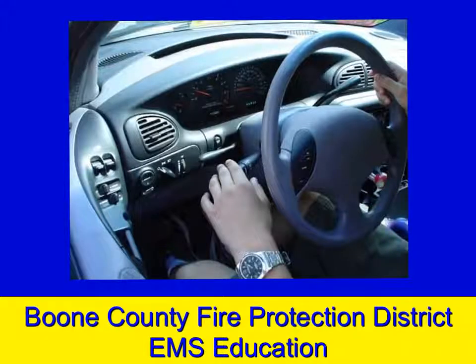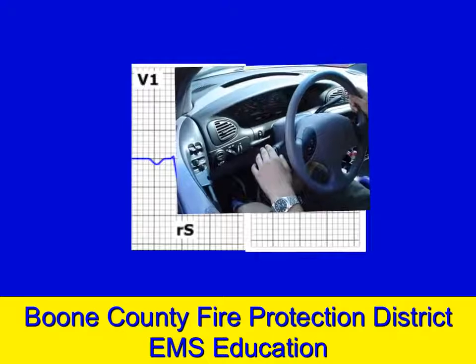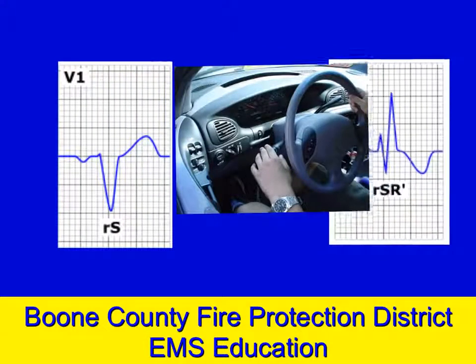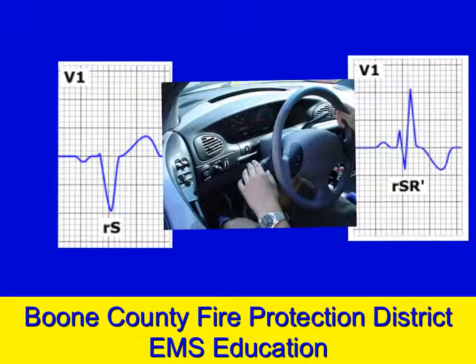The metaphor here is the turn signal in your car. You pull down to signal left, you pull up to signal right. So I'm going to move our turn signal out of the way and move a couple of complexes into view here. A key point here is that you must be in lead V1. If you're not in V1, this does not work for you.